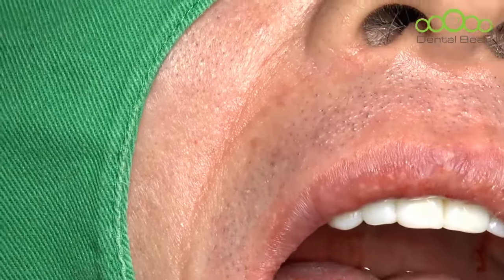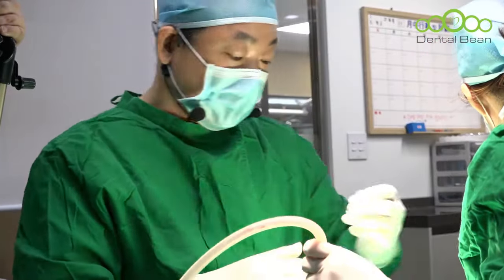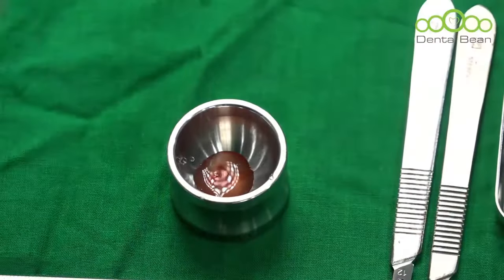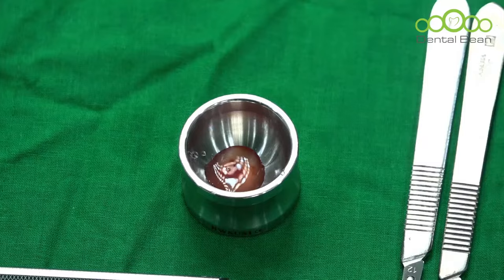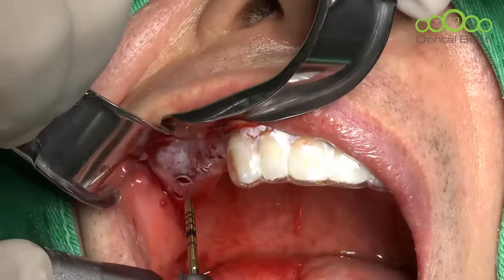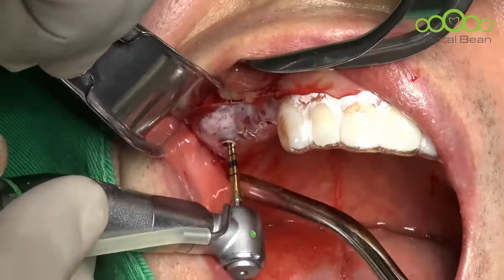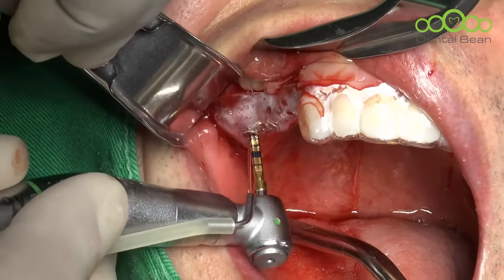First, I'll try crestal sinus bone augmentation with a guide. I made a very simple surgical guide with OmniVac like this, so I can mark the entry point exactly. I will use a guide at number 6. This is 4, 5, and number 6. So I'll mark the entry point of number 6.